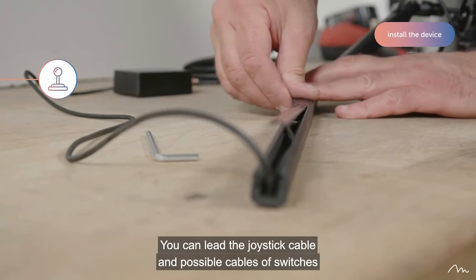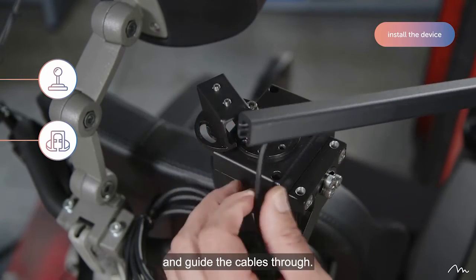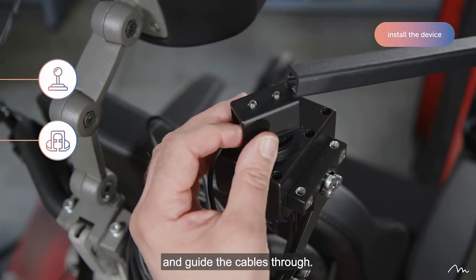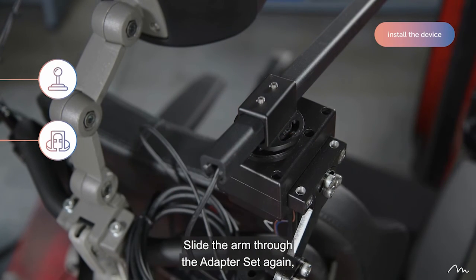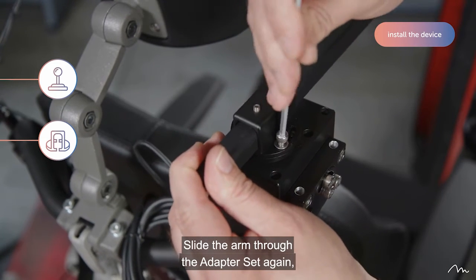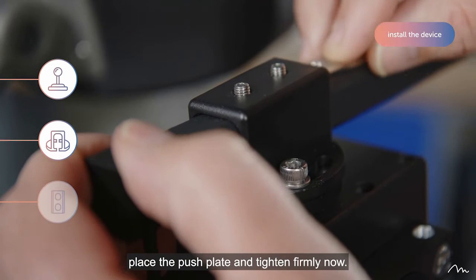You can lead the joystick cable and possible cables of switches through the extrusion. Remove the adapter set again and guide the cables through. Slide the arm through the adapter set again. Place the push plate and tighten firmly now.